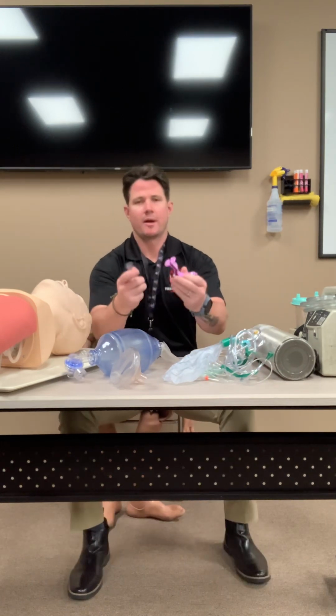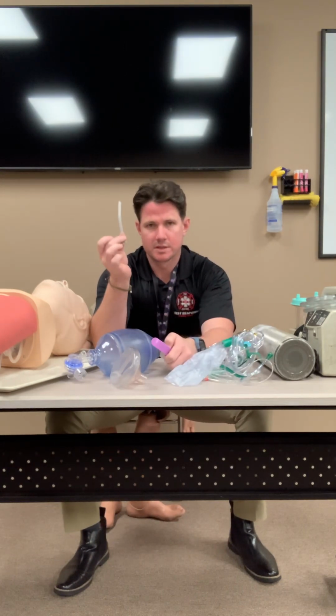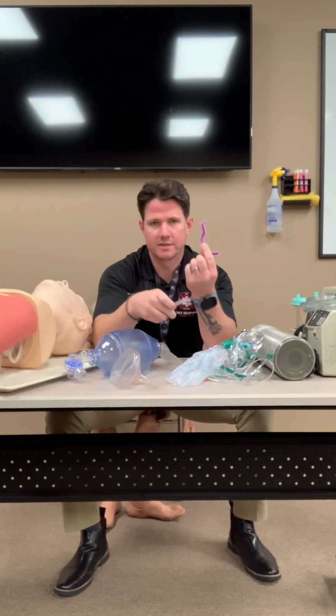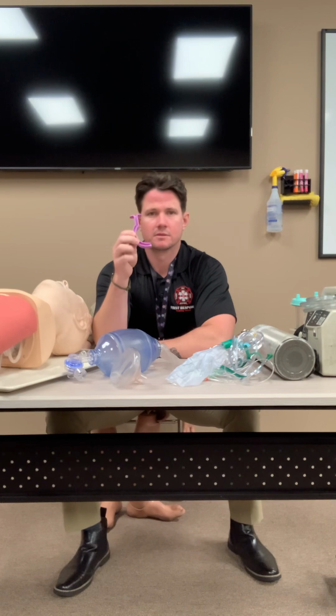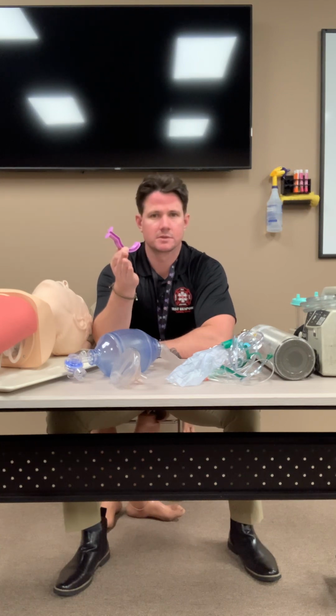So let's talk a little bit about our airway adjuncts, all right? This is my OPA. This is my NPA, okay? OPA stands for oropharyngeal airway, NPA stands for nasopharyngeal airway. Contraindications to my OPA: gag reflex or a conscious patient. Indications: no gag reflex, unconscious, cardiac arrest, okay?